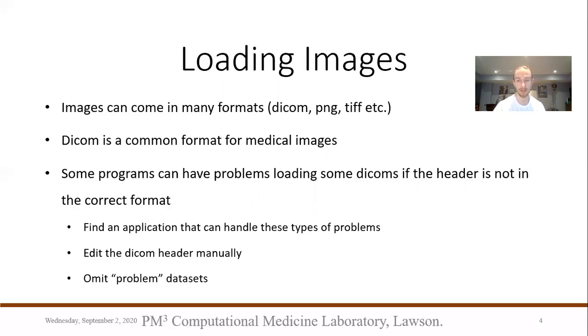What you can do to deal with this problem is you could find an application that can handle these types of problems. For example, MATLAB is quite good at handling DICOM headers. You could also edit the DICOM header manually using a program that can do that. Or what some scientists will do is they'll just omit these problem data sets.